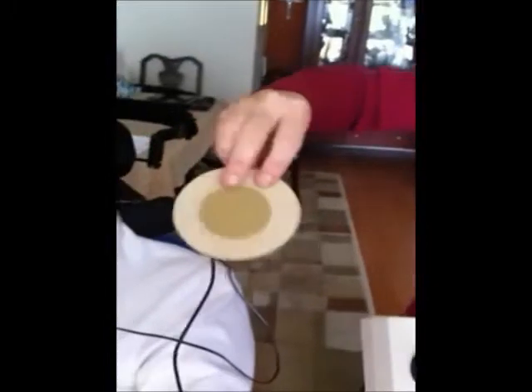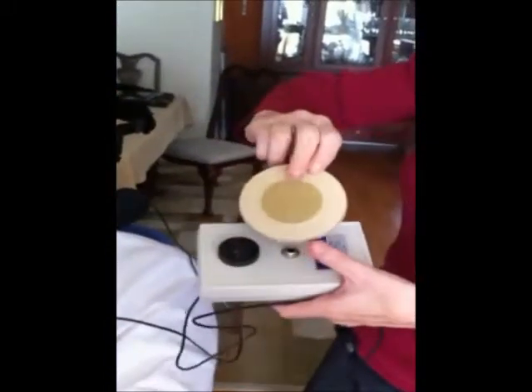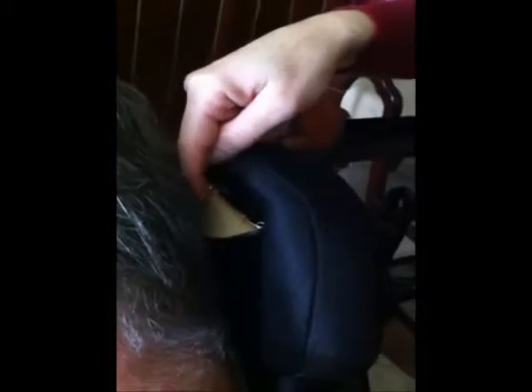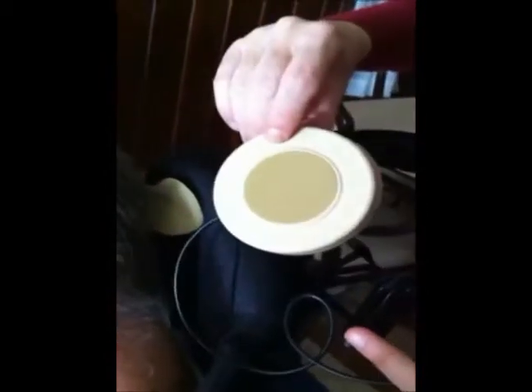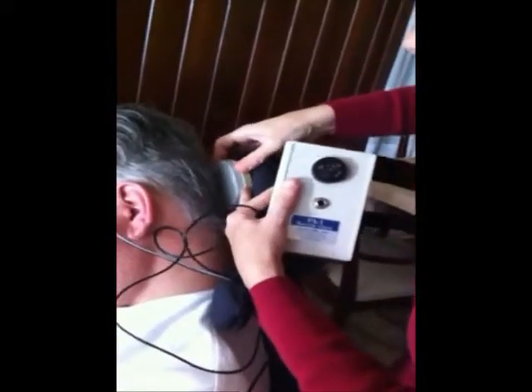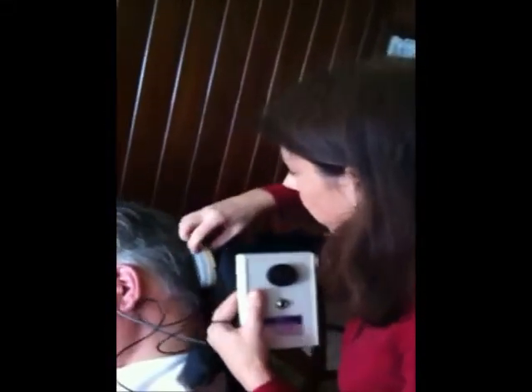This is a switch called a pillow switch. You can get them online — search for pillow switch. It's got a little bit of Velcro on the back. All I did was put a little bit of Velcro on the back of his headrest, and it's held there with a safety pin. The pillow switch comes with both of these pieces of Velcro. I need to find a spot for Ozzy where he can stay off the switch when he wants to, but also push his head up against it when he wants to activate it. We found a spot behind his head where he can hit the switch when he wants to.